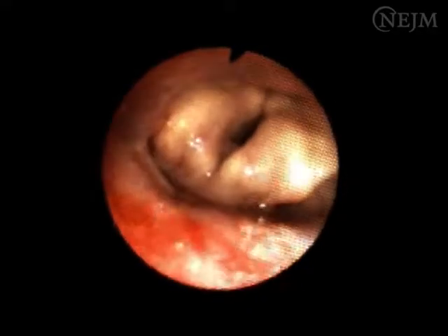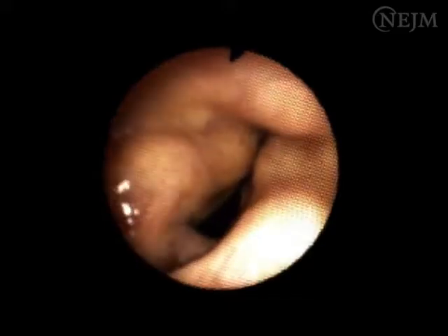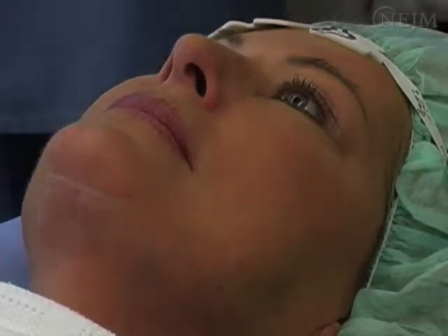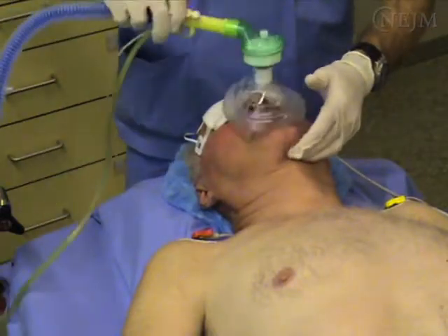Fiberoptic intubation plays an important part in the management of a difficult airway and is recommended by many societies of anesthesia. It is primarily important for the management of the anticipated difficult airway, but can also be used to secure the airway in an unexpected situation.